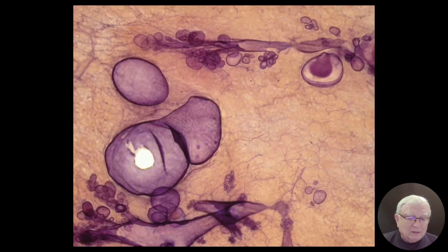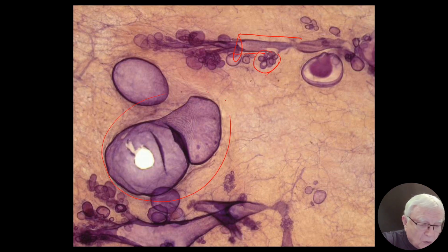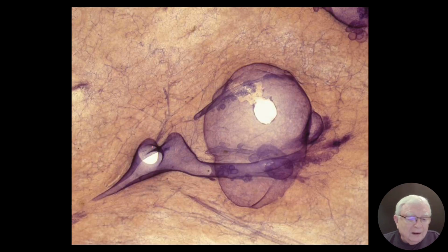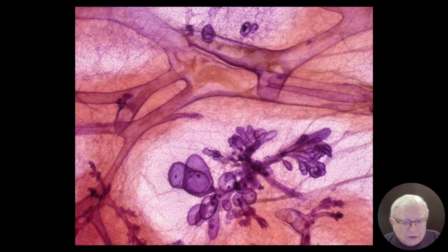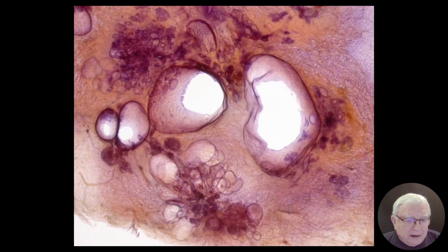And then you can get very cute pictures. This is ductectasia, microcystic, more larger or varying size of cystic dilatations. And here's a bird. Fibrocystic change. Ductectasia, fibrocystic change, mastodynia, breast pain, small, large. Here is a problem. Whenever fluid stagnates, then calcification can be formed.